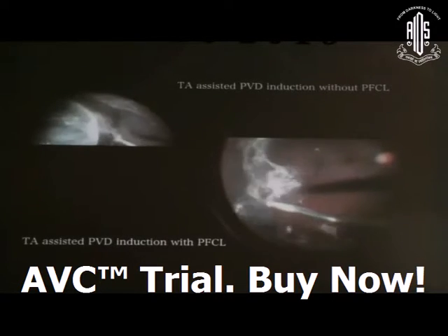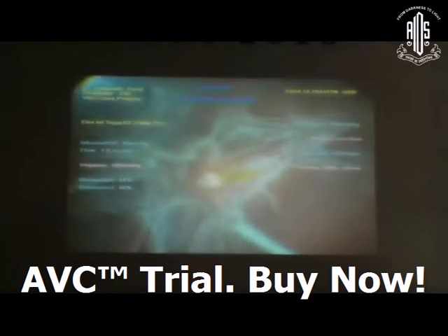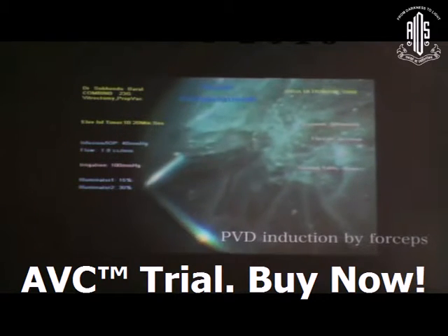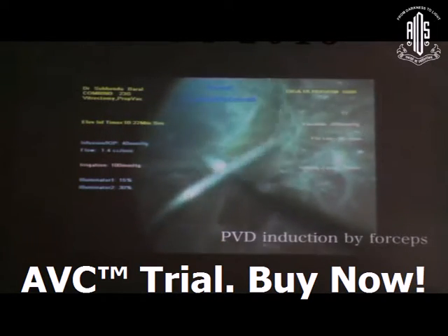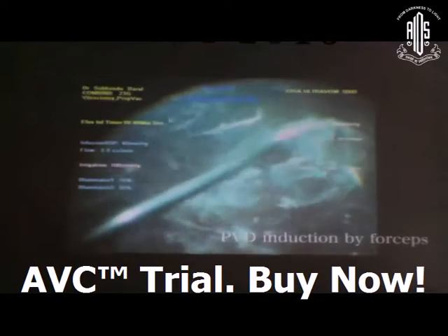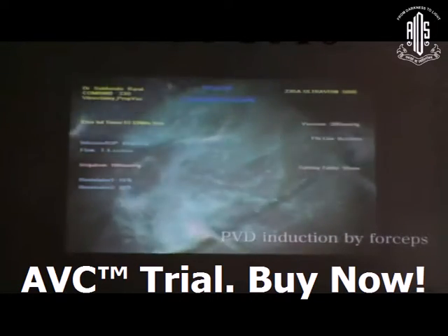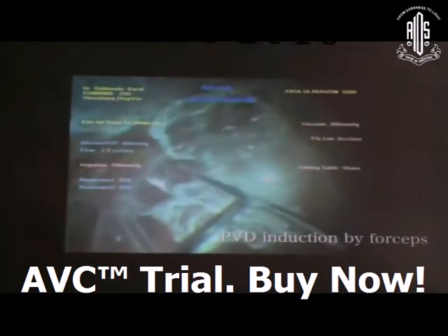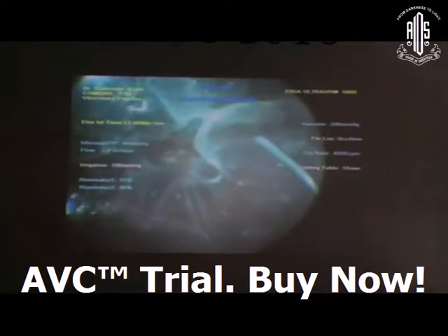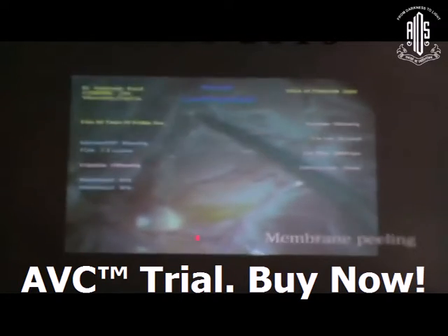The next step is membrane peeling. When you are dealing with PVR — fixed fold or star fold is the hallmark of PVR — PVD induction should be completed bimanually. You stain with triamcinolone acetonide, then induce PVD bimanually with the help of a grasping forcep as well as your light pipe or cutter, and trim the peripheral part.